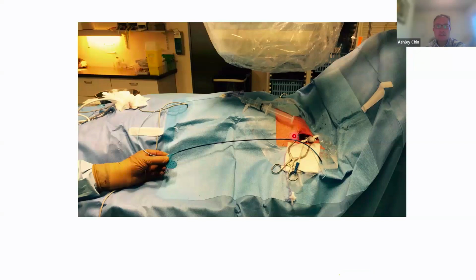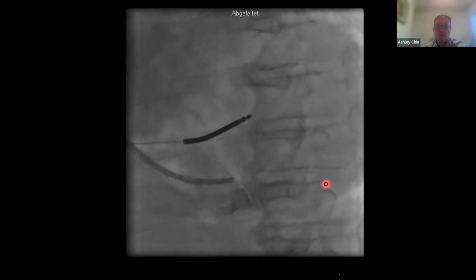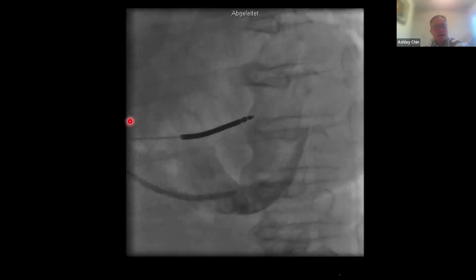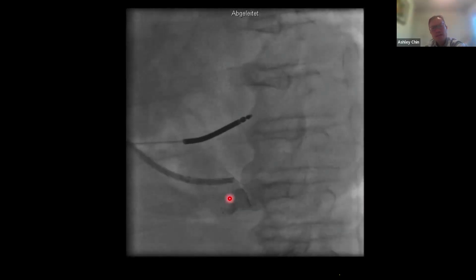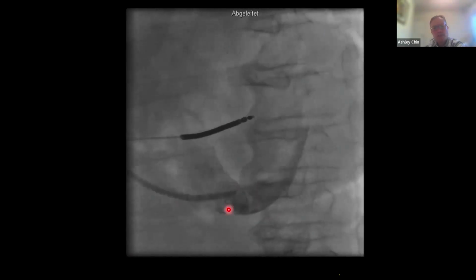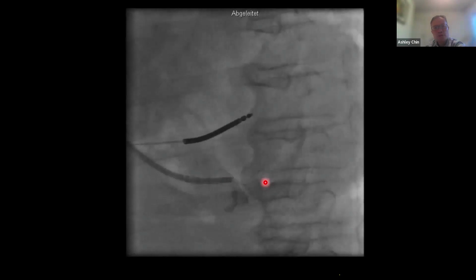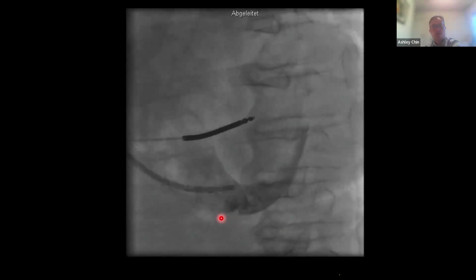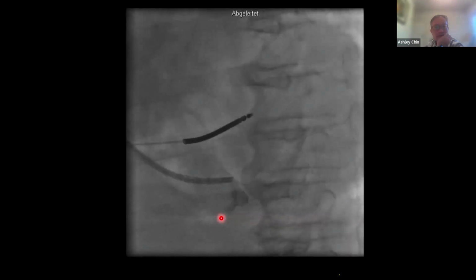All right, so the CS cannulation without a steerable catheter. Here's an example of how you would do it. Here's a biotronic sheath. Here's an inner coronary catheter. This is another technique that you can use. I don't use this anymore. I find sometimes that you might end up using quite a lot of dye. You can imagine the Thebesian valve being here, and it's quite difficult sometimes to advance it across. But certainly you could use this if you decide not to use the CS catheter.